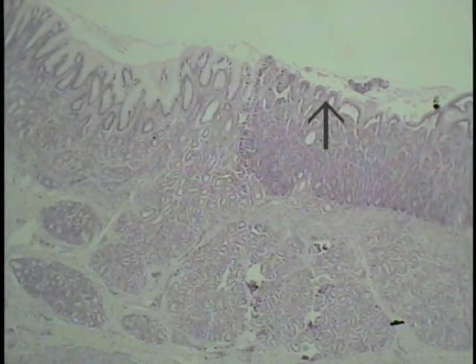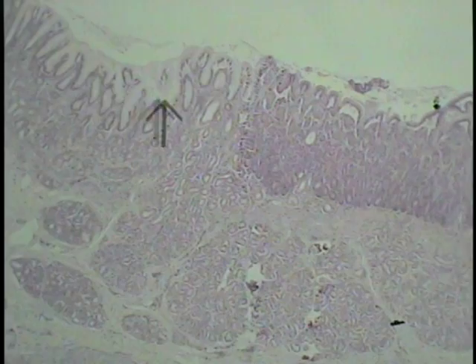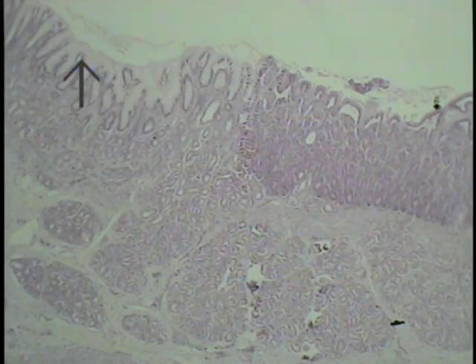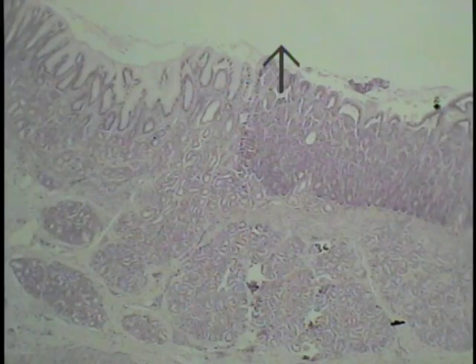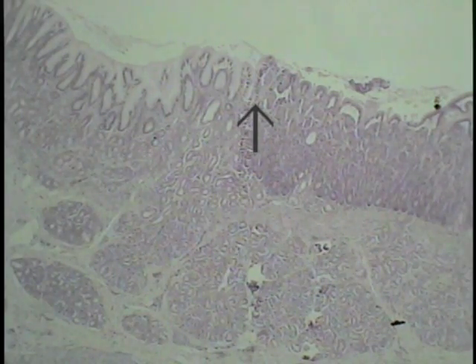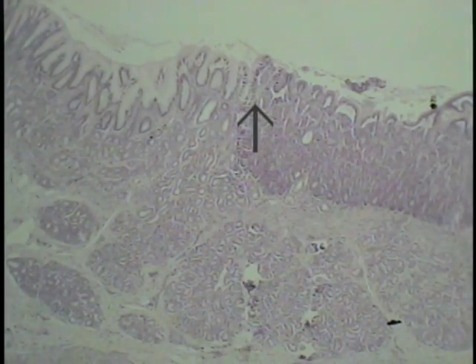That is a darker staining type of epithelium, and one that will be heterogeneous, being populated by typical enterocytes with the microvillous border, goblet cells, and a variety of enteroendocrine cell types. So we're going from a purely mucin-secreting type, a very homogeneous type of epithelial lining, because all the cells are virtually of the same type, to one that's heterogeneous, with a variety of cell types associated with it. But in this particular area, the dominant cell type will be the enterocyte, that intestinal absorptive cell with the microvillous border.